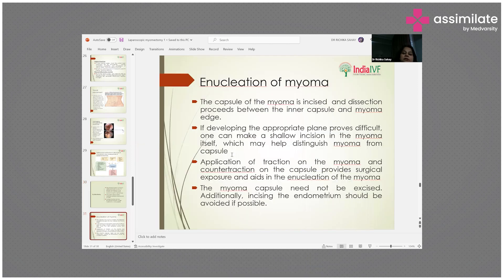For enucleation of the myoma, the capsule of the myoma is incised and this dissection proceeds between the inner capsule and myoma edge. If developing the appropriate plane proves difficult, one can make a shallow incision in the myoma itself, which may help distinguish myoma from capsule.